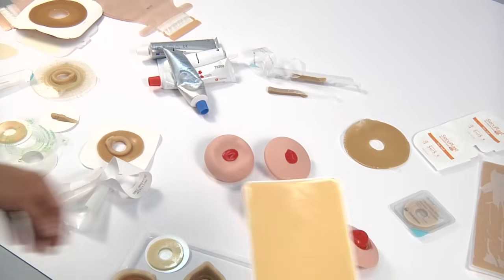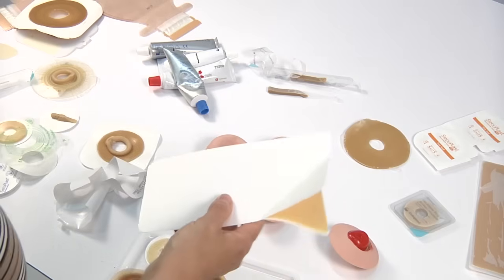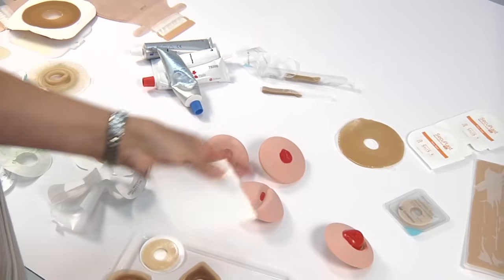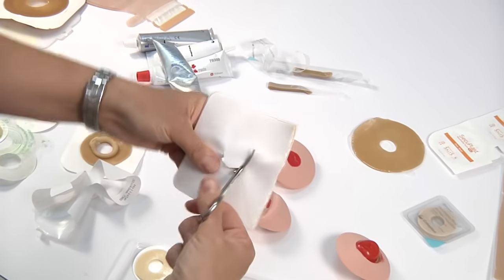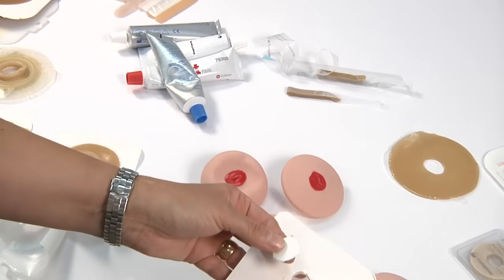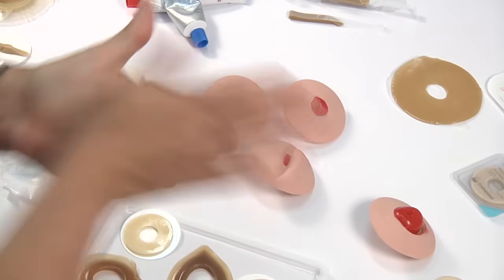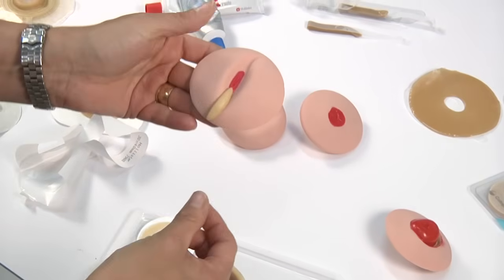You can, as I said, take little strips of this. I'm actually going to cut a little piece off here. And depending on what you want to do, as I did with that other sheet, you can either cut a hole in the center to match your stoma and use it as that interface, or you can take those little pieces and again use that to fill in any creases that you may have. You can roll and manipulate that so that it fills into the crease. Okay.